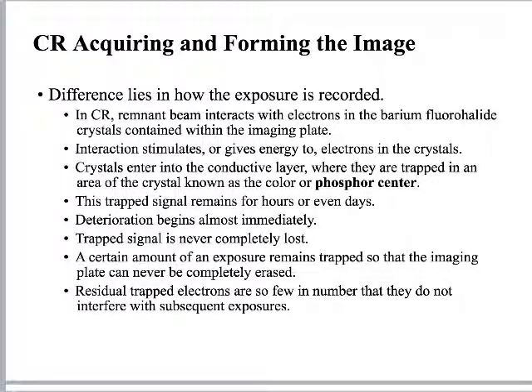That trapped signal can last for a long time. It can sit there for a long time like this. But the deterioration does start almost immediately. So the big story here is develop your CR cassettes as quickly as possible, right? But that trapped signal is almost never completely lost. If you waited 2 days and developed it, there would still be an X-ray image there. You would have lost some of it, but not much.